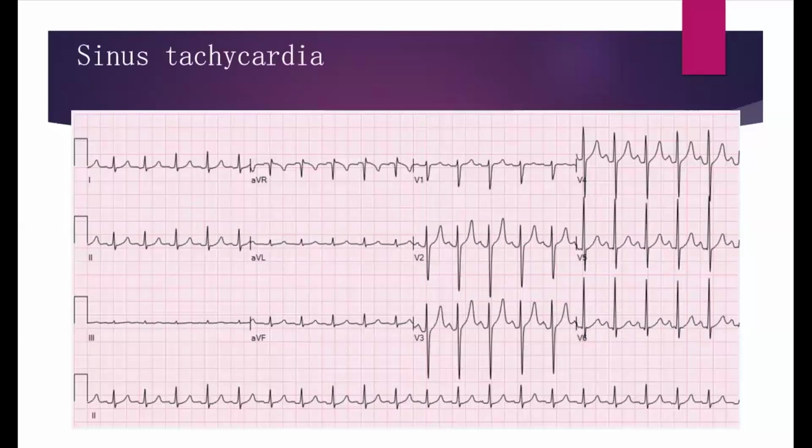So this is an example. This is a 12-lead ECG. You look at it, and you see that the general impression is a fast ECG. And you look at the calibration, and you see that it's a standard calibration. Okay, let me use the highlighter. So it's a fast ECG, okay? And then you look at the standard calibration. You say it's standard.